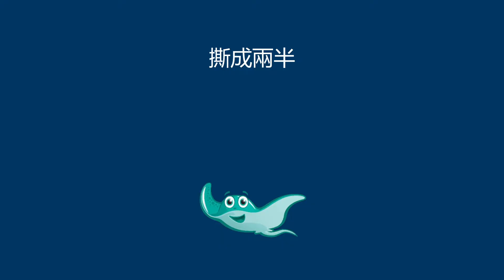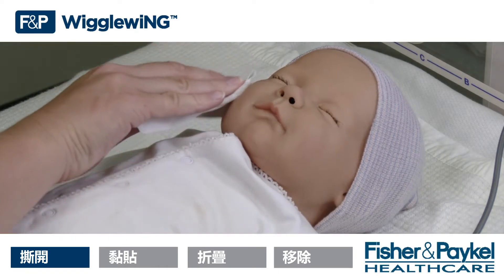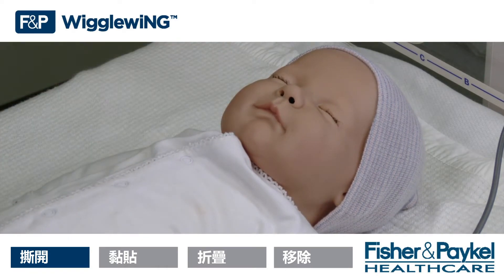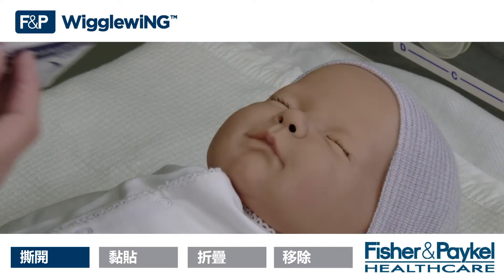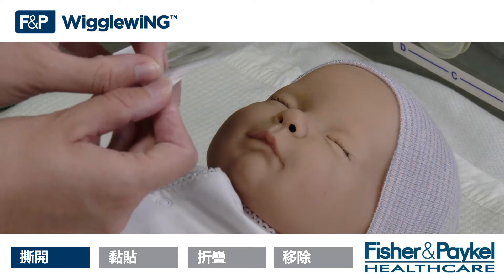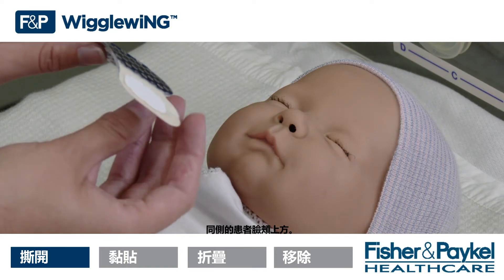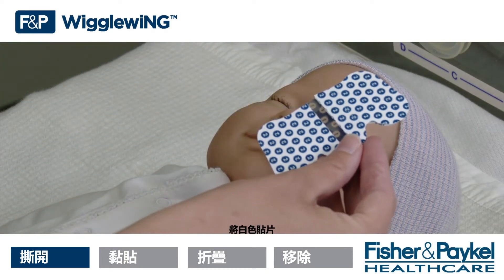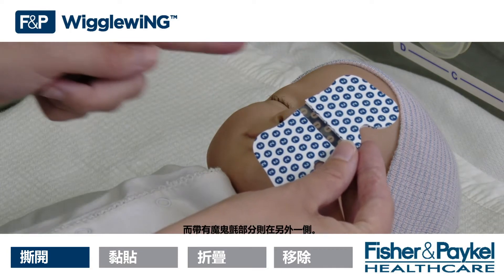Rip in two. Prepare the patient's skin according to hospital protocol. Determine which nostril you would like to place the NG tube in. Hold the FMP Wiggle Wing over the patient's cheek on the same side as this nostril. Face the white tabs marked 2 towards you and the hook pads away from you.